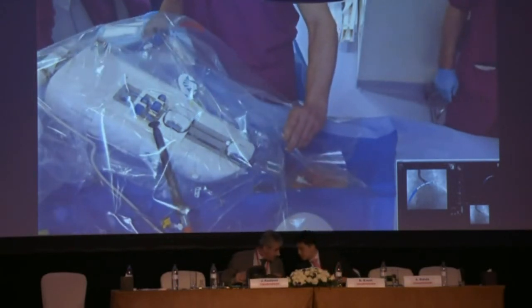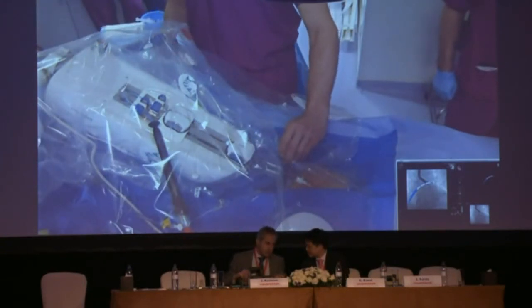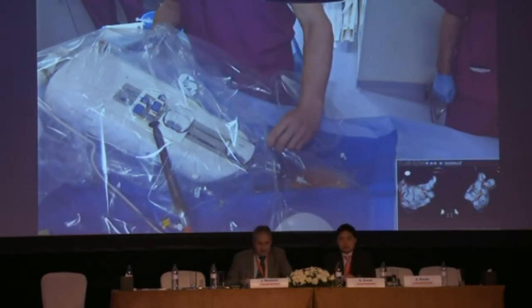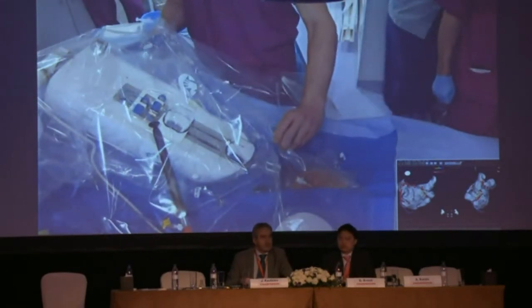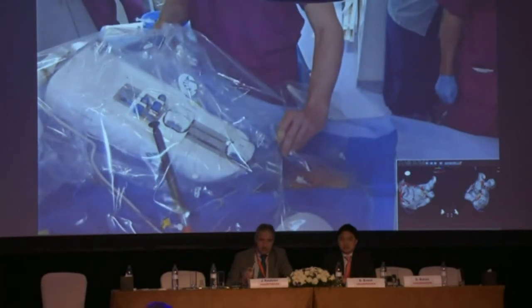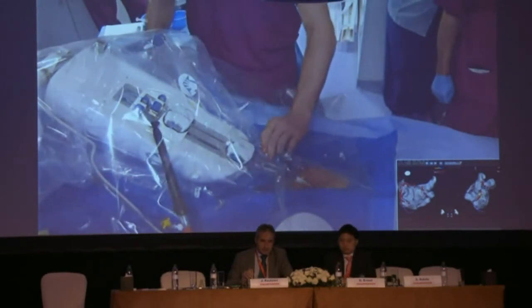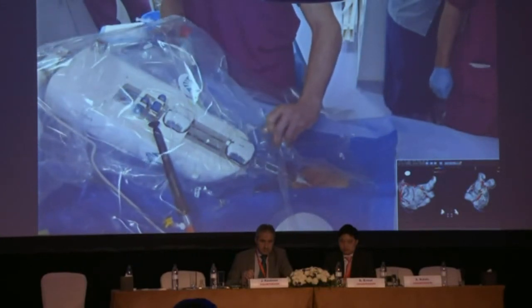I basically kept on dragging my mapping catheter back from lateral to septal until I no longer saw a gradient between the distal and proximal, suggesting that I got to the point where activation was not coming past the proximal electrode to the distal electrode, but was actually bridging, in the middle of those two electrodes. So that's how I got there. It was sequential mapping rather than a complete mapping. I just kept on going until I got as early as I could and then stopped.